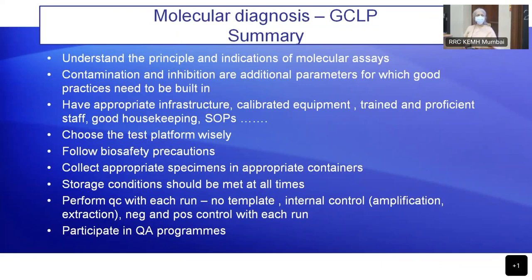Three. Choose the test platform wisely. So can you tell me what I mean by this? If I'm using an RT-PCR assay, then it will have an internal control in addition to the specific genes for that target, for that organism.